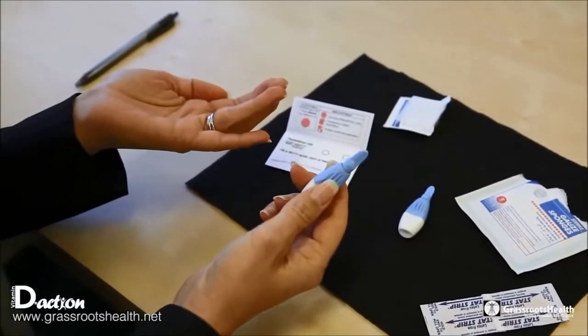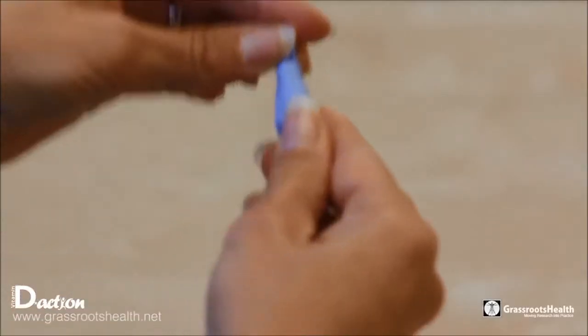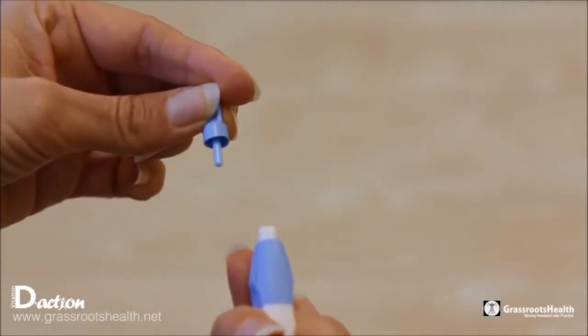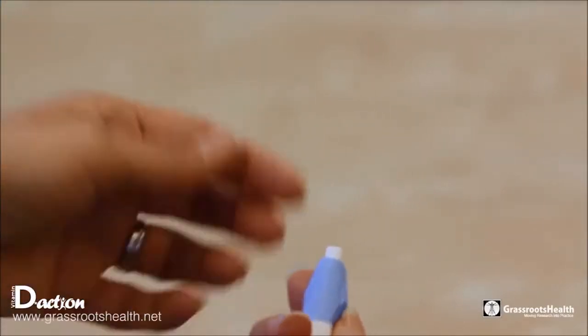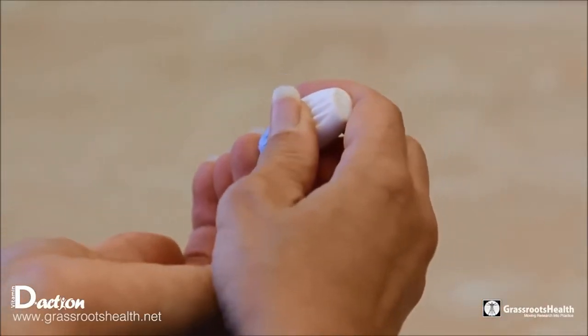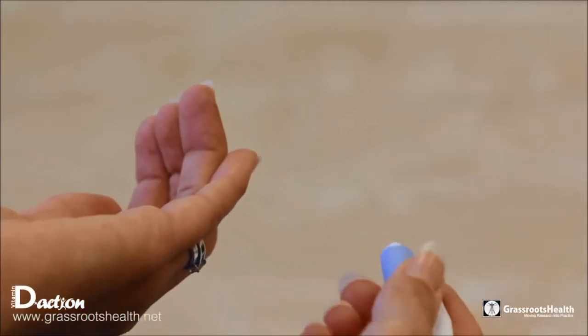Take a look and see how the lancet is opened. Generally you'll only need one — there's an extra one in there. You just take off the top of it, press it up against the side of the finger, and press, and it gently clicks.